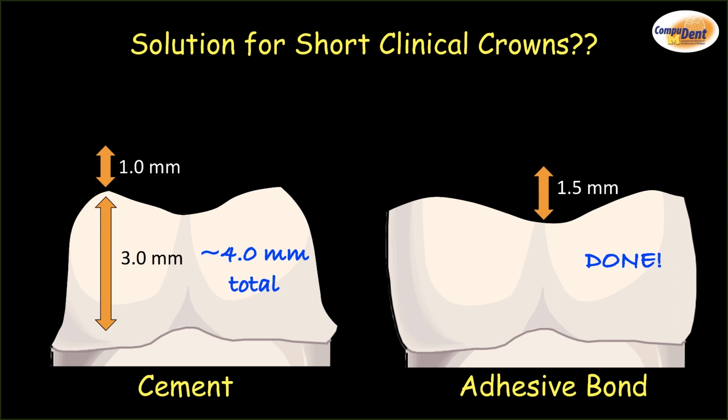Yes, you could move it because it's not bonded, but you would have some resistance to that. It would key itself in place because you have topography. Then harken back to when I was talking about putting that composite in. Why do that? Don't. Let that internal dimension of the old restoration also improve your bonding by being able to bond directly to the tooth and give you that resistance in the prep to key it in place.